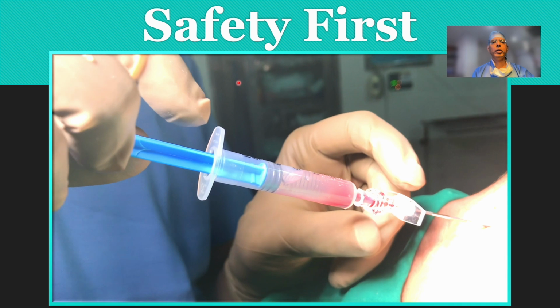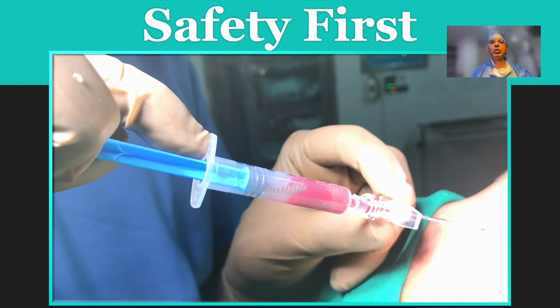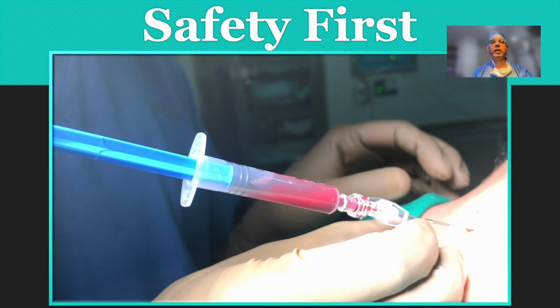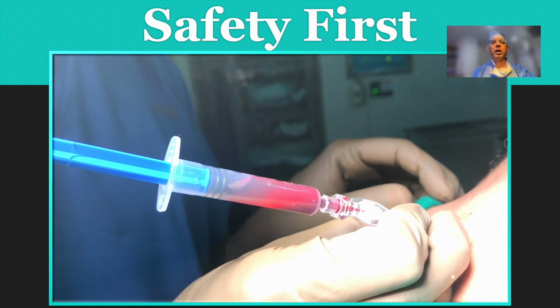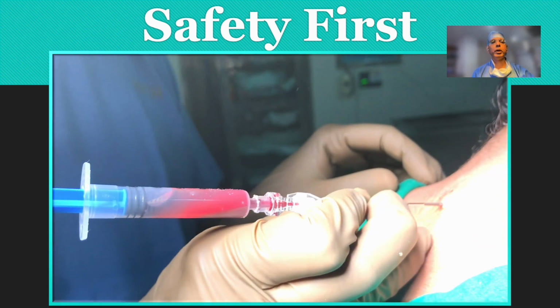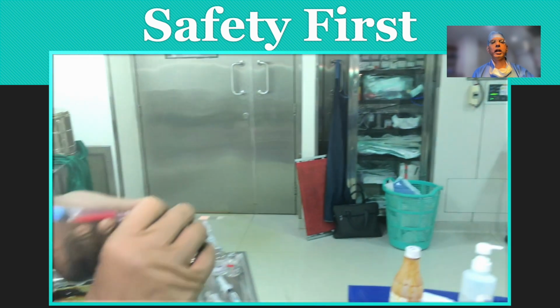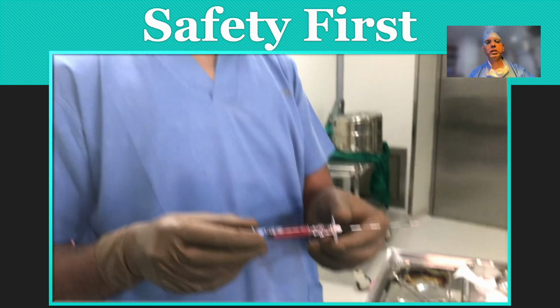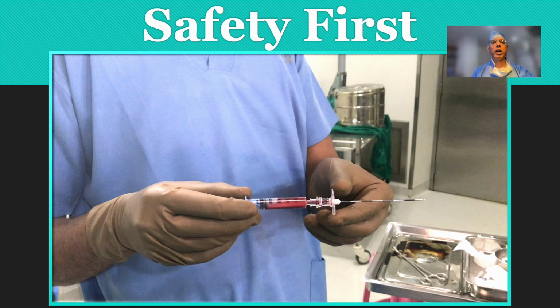This lady, weighing around 40 kg, was posted for cervical epidural steroid injection. Identified epidural space under fluoroscopy with hanging drop technique. Before injecting dye for epidurography, I aspirated, which I follow religiously, and there was frank blood. I removed the needle and tried at another space with the same results. We abandoned the procedure. We should not compromise safety whatever technique we use.